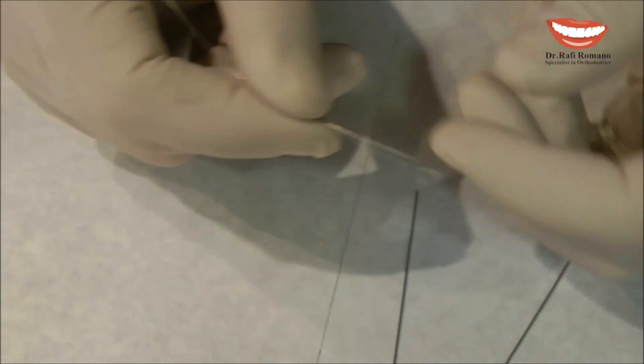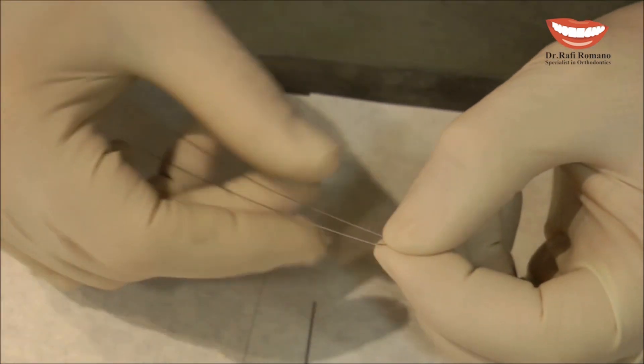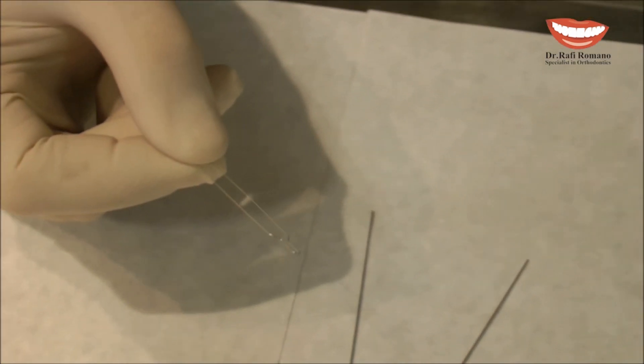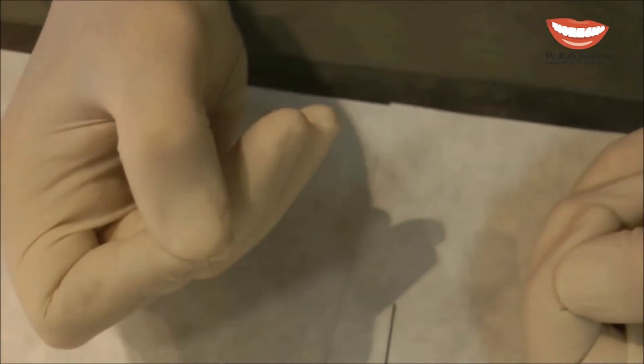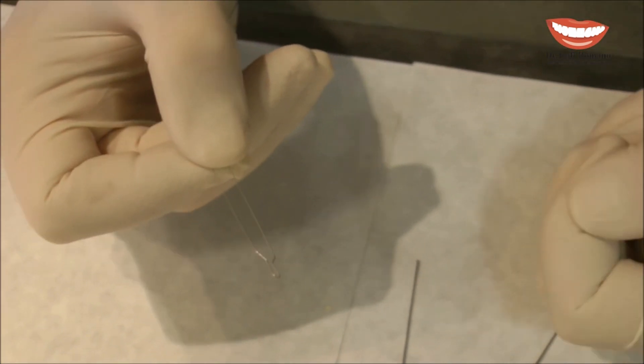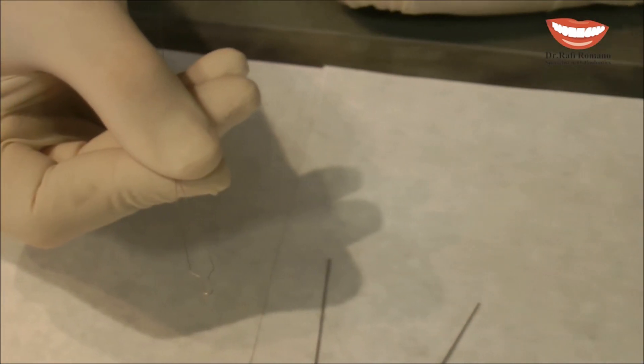To do figure 8 is very easy. You go with the ligature down the bracket, up the bracket. I usually do it under the wire so I can put the wire inside and do not need later on to replace this metal ligature.